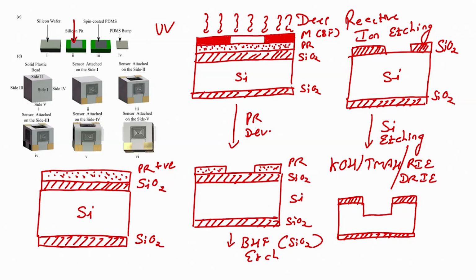Now, on this silicon pit, if I pour PDMS and cure it, let us draw PDMS in this particular fashion. In this silicon pit, what I have done? I have poured PDMS and cured it.